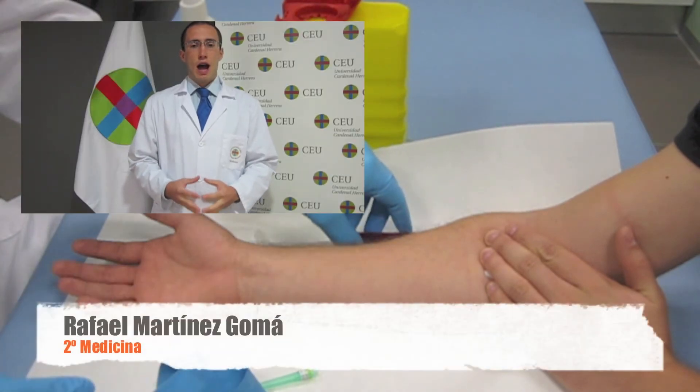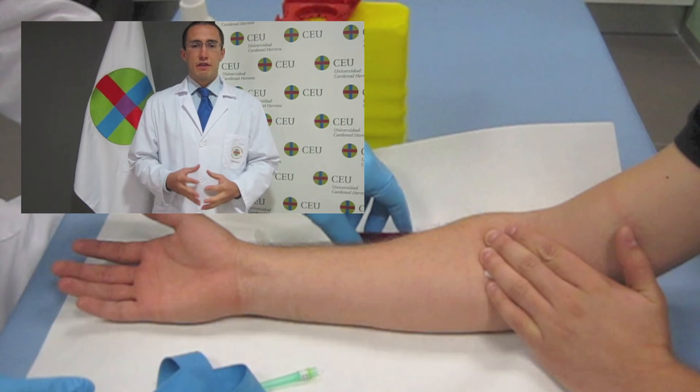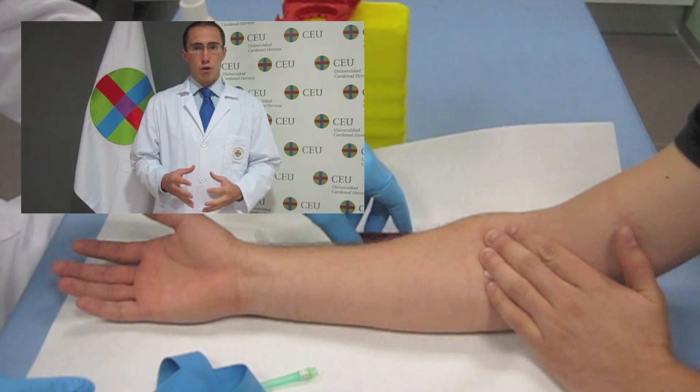Al finalizar la extracción aplicar presión únicamente en el lugar de la punción. Con ello se favorece la formación del coágulo y se evita la extravasación de líquido, la formación del hematoma y el dolor.